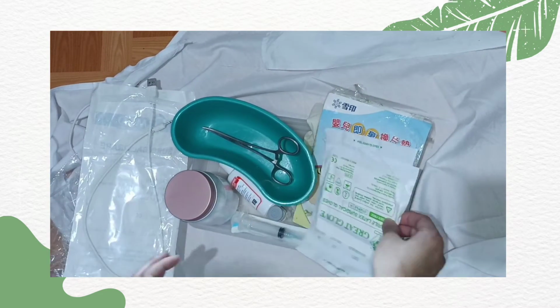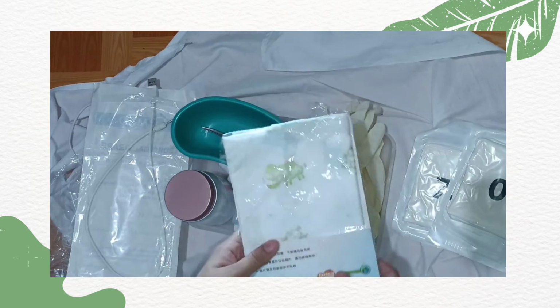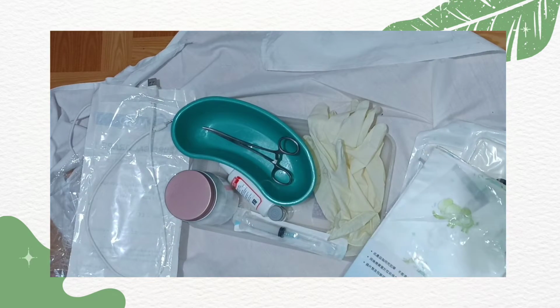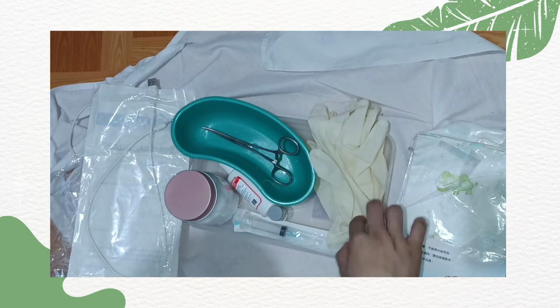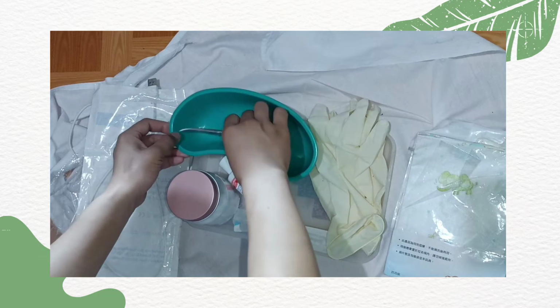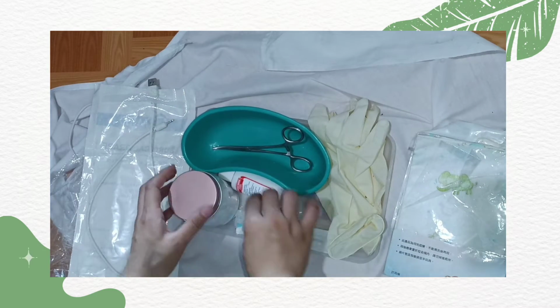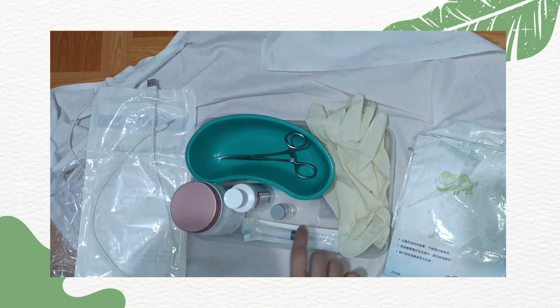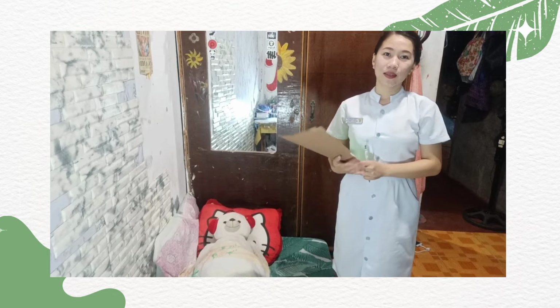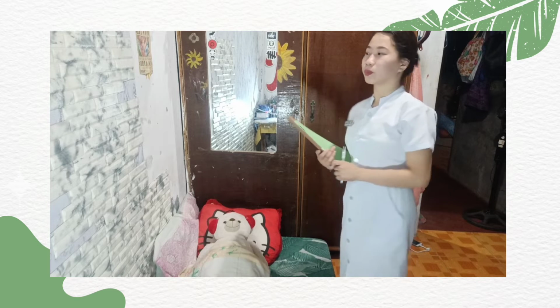And we have two sterile gloves, a waterproof pad, clean gloves, forceps, basin, cleansing cotton, lubricant, and syringe. Next, I am going to introduce myself to the patient and verify the client's identity.